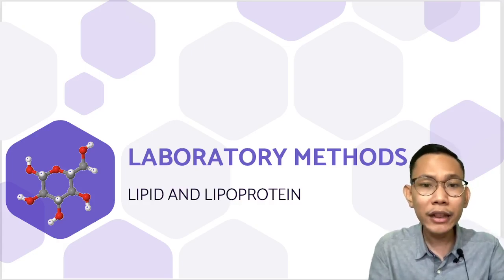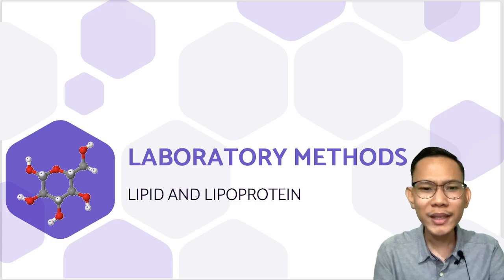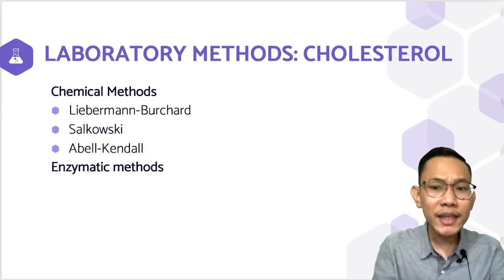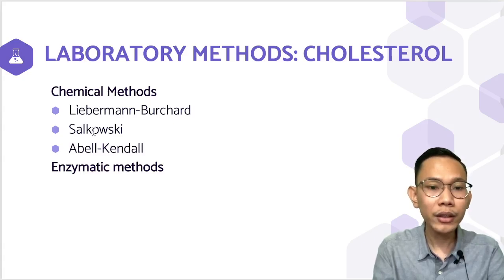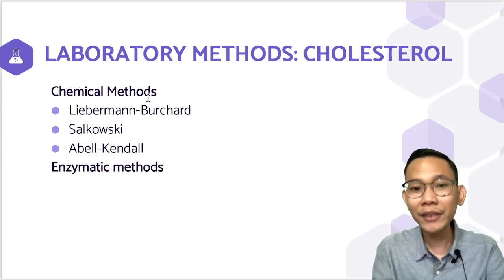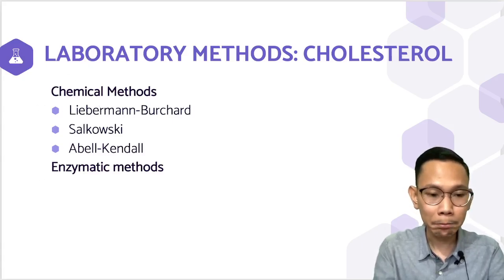Now, we will proceed to the different laboratory methods sa ating lipids and lipoprotein. These are the most common methodologies that we employ in testing your lipids. So, let's first discuss your cholesterol. For your cholesterol, meron tayong tinatawag na chemical methods by Lieberman-Burchard, your Salkowski, and your Abell-Kendall. So, these are the most common chemical methods for your cholesterol. Again, remember this guys. And also, your enzymatic method. So, nade-divide ang laboratory methods for cholesterol, either chemical or enzymatic.